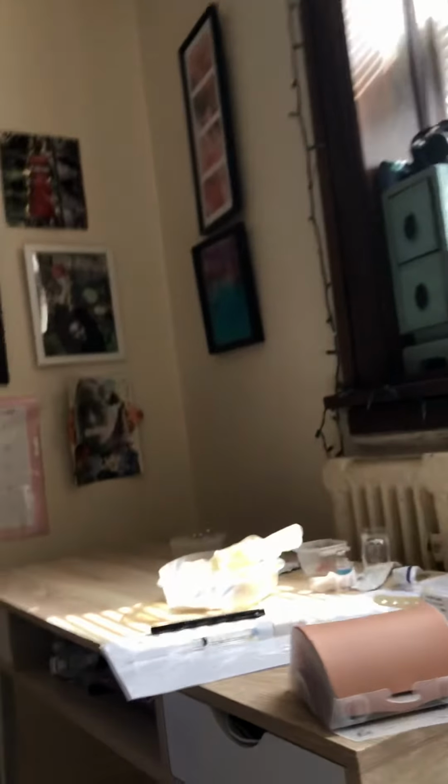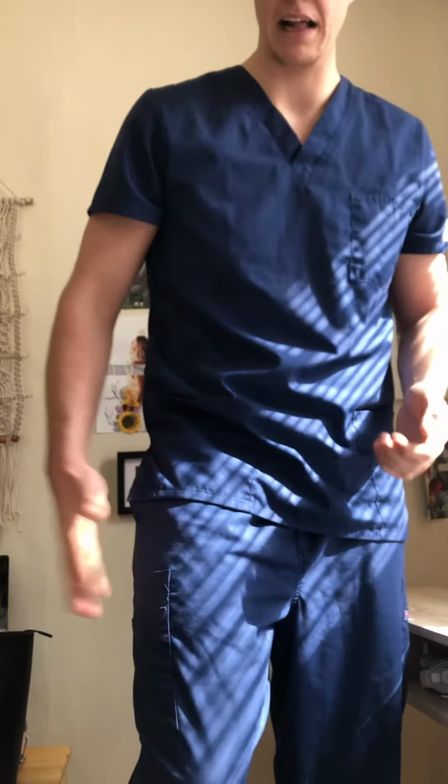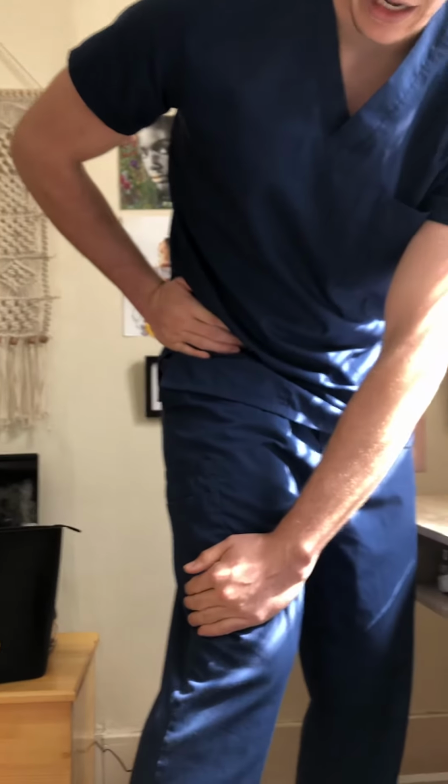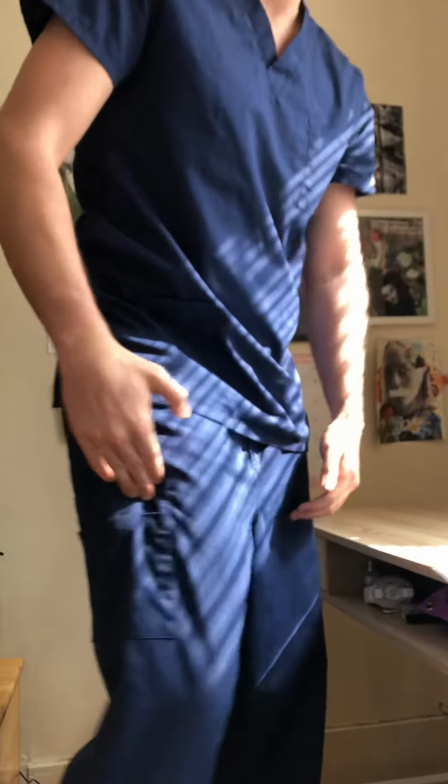So now I'm going to perform hand hygiene, and I'm going to just landmark where I'm going to go, so the patient knows. So I'm going to be giving this into your muscle. I'm going to be doing it in your vastus lateralis. So to landmark, have one hand on your greater trochanter, the other one just above the knee, and I go halfway in between those, so right here.